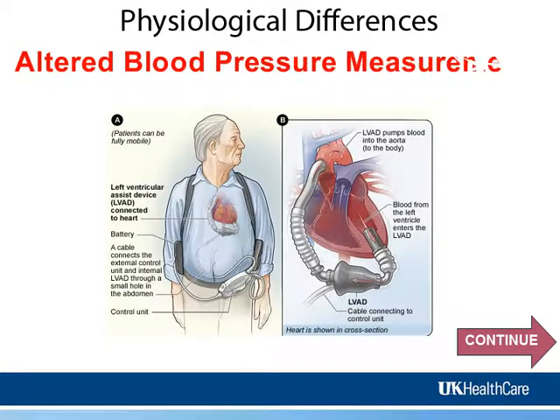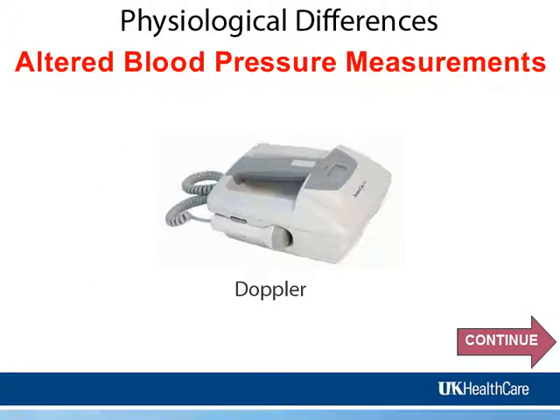No blood pressure. Because of the left ventricle being unloaded with the blood pump, and thus reducing the overall left ventricular pressures, the aortic valve will be challenged to open well every beat. With most LVAD patients, the aortic valve will only open every 3 to 4 beats. Most patients do not have an audible blood pressure, and have a narrow pulse pressure, that is 90/80. A Doppler is required for most patients to auscultate a blood pressure.